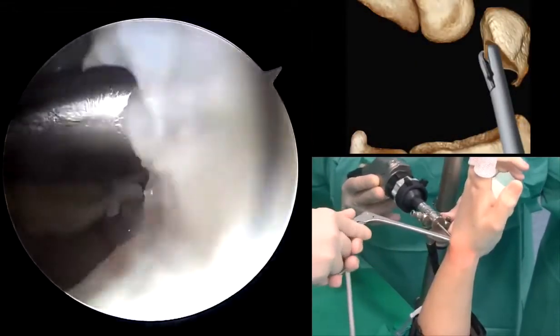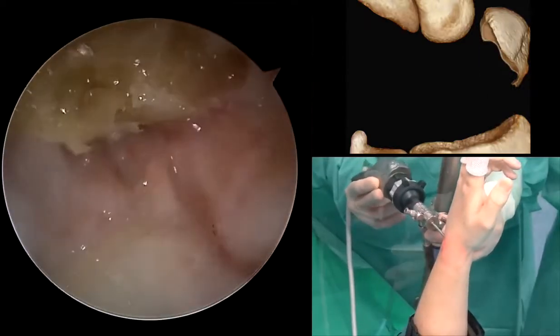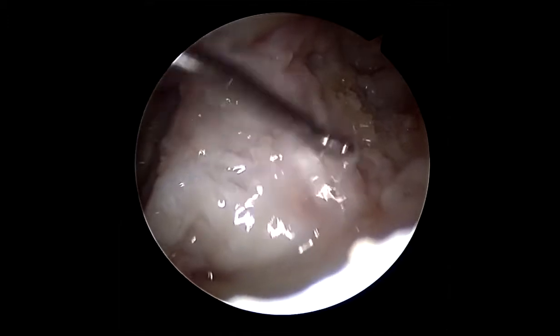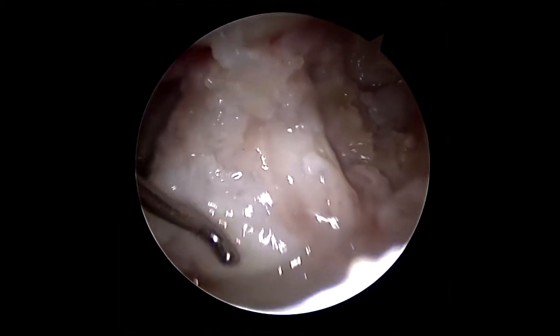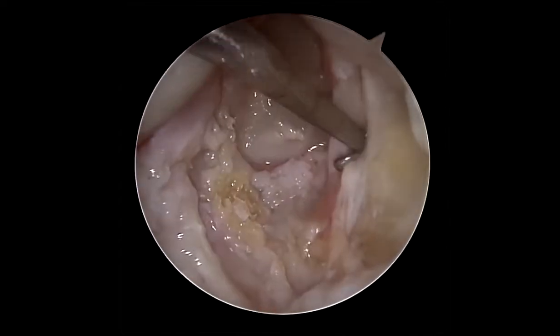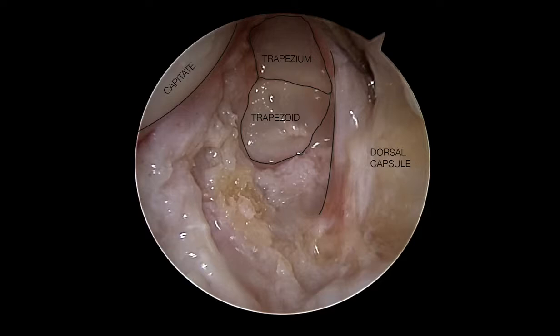Finally, the dorsal portion of the scaphoid is resected in the same way through the radial midcarpal portal. This is the final result. This is the radioscaphocapitate ligament. The trapezium-trapezoid joint on the radial side.